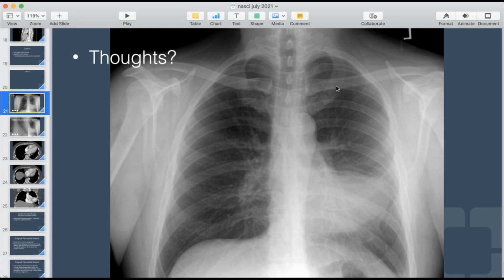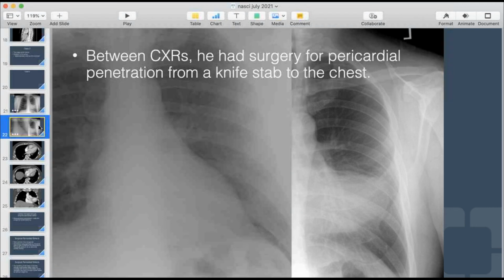All right, this is a good case. I'm assuming everybody can see my screen because I have it here on the little window. Whoever wants to participate and make comments, that'd be great.